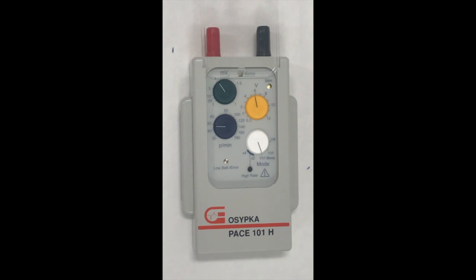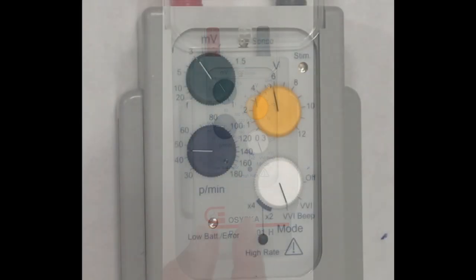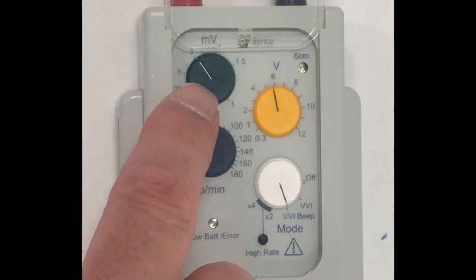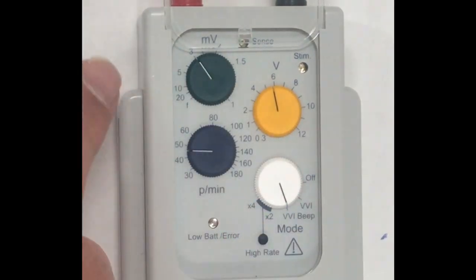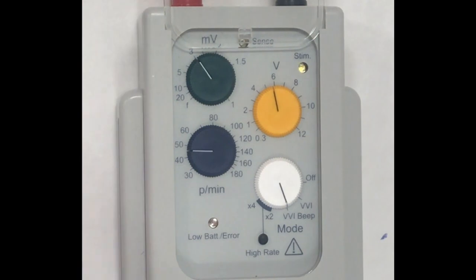To get an idea of how big the R-wave is and how good my device is at sensing, I now need to make the device gradually less sensitive. The way I do that is I take the sensitivity control here, which is currently set to 3 millivolts.